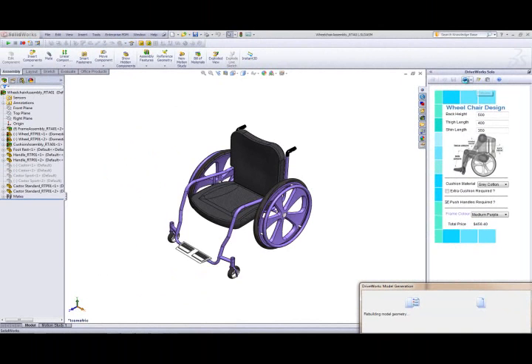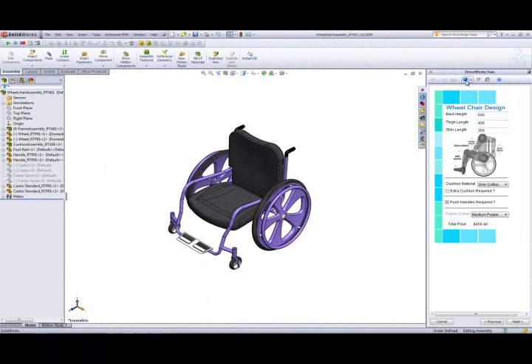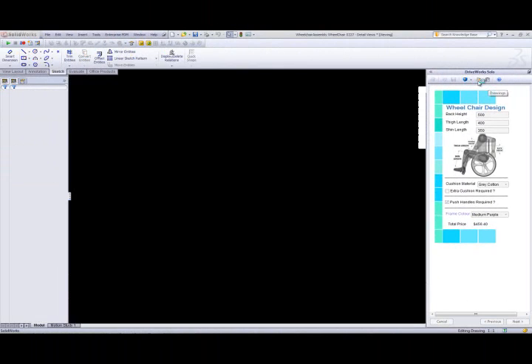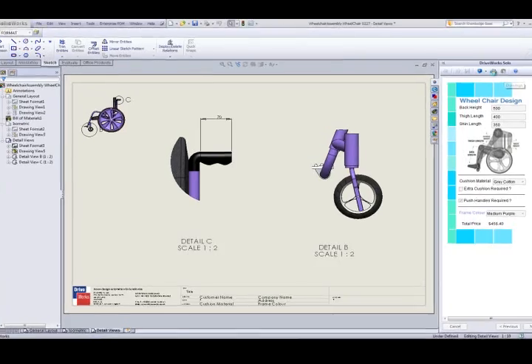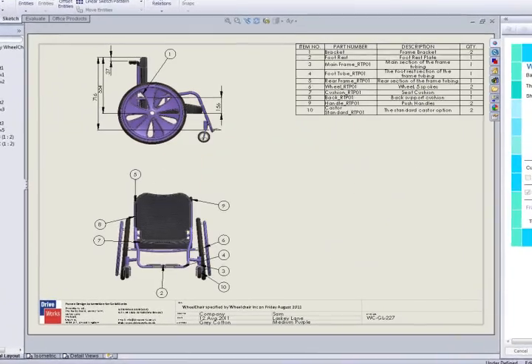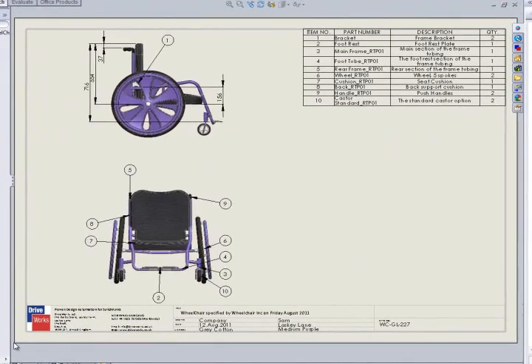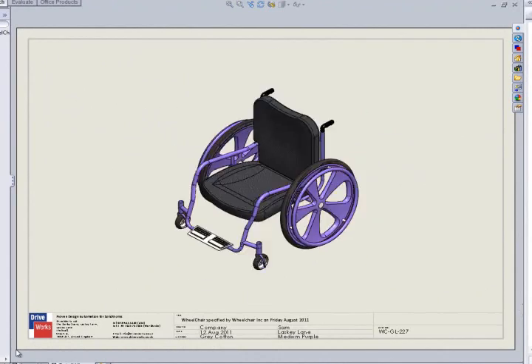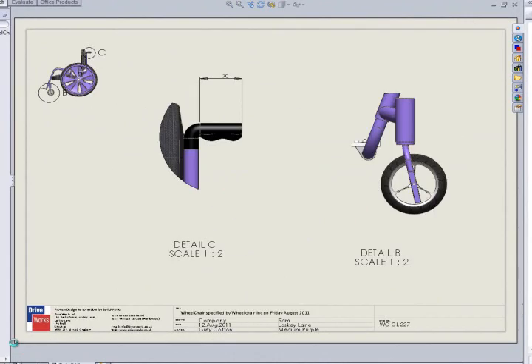As well as previewing the model, we can also preview the drawings. Next to the model preview button, we have a drawing preview button. While selecting this option, DriveWorks Solo will generate a preview of the general arrangement drawing that we have for this wheelchair project.